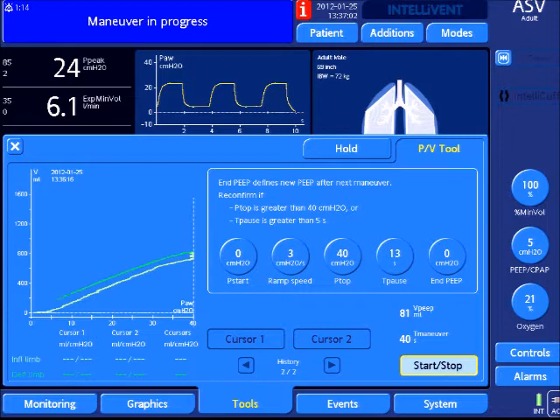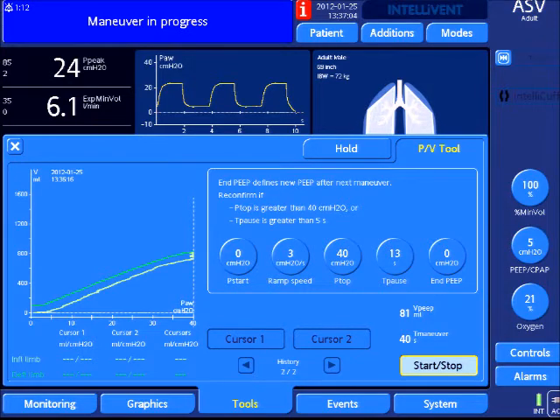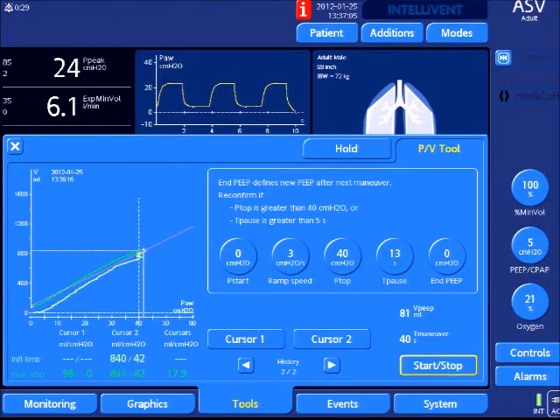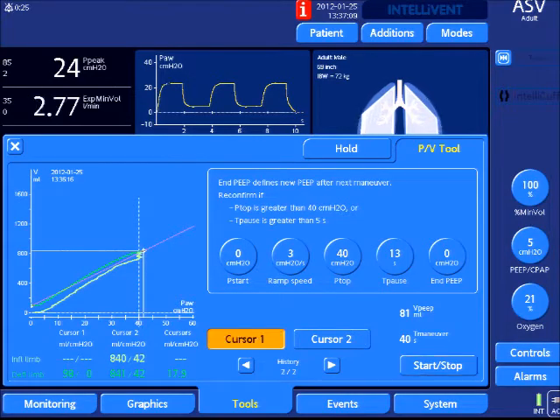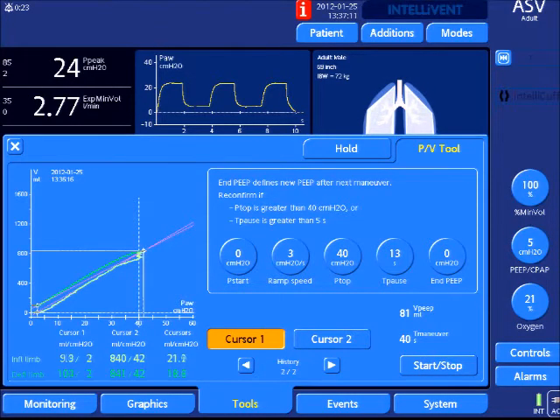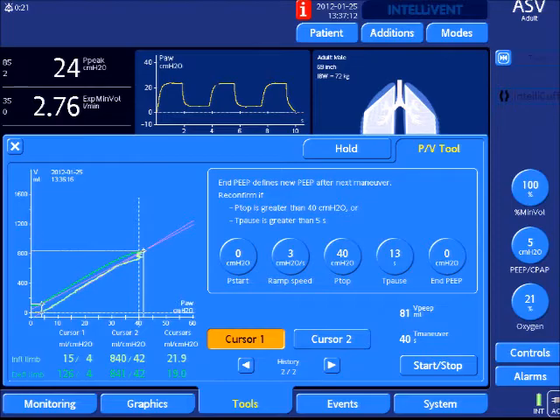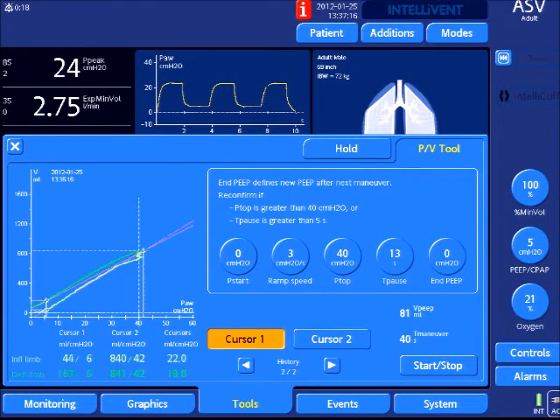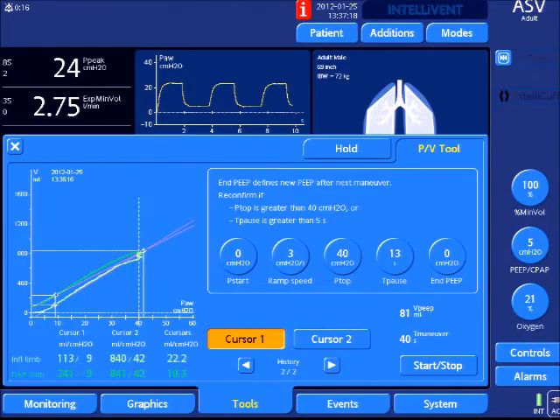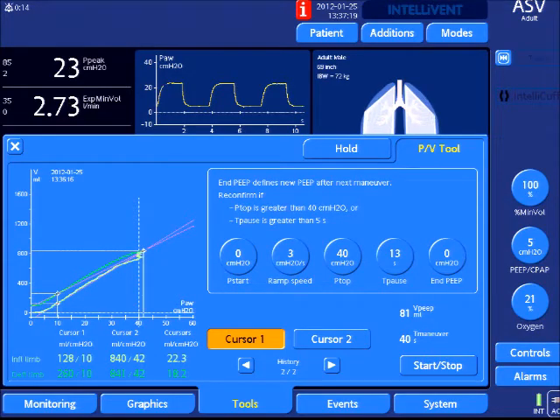My colleague Dave is using the cursors to evaluate to see if there's any inflection point and to look at the hysteresis. It's very thin, very narrow. This lung is not really that recruitable, so they might not respond well to APRV at all.